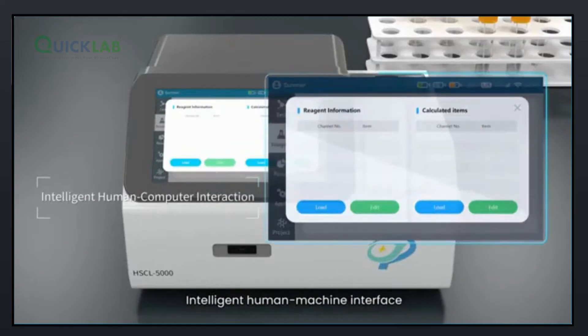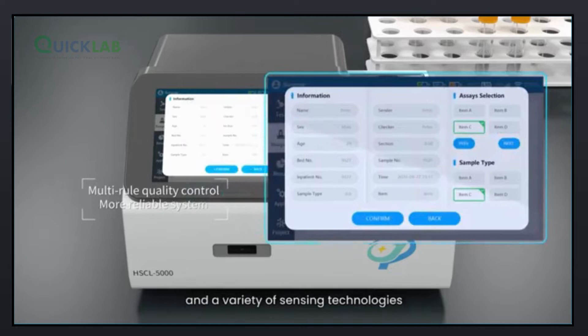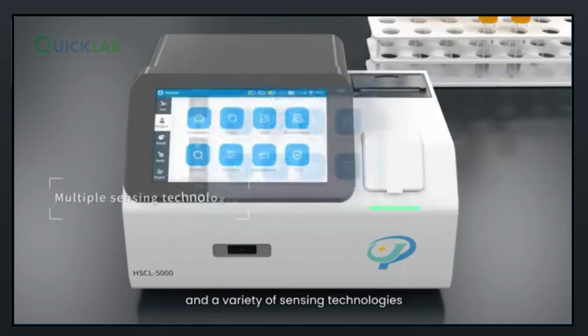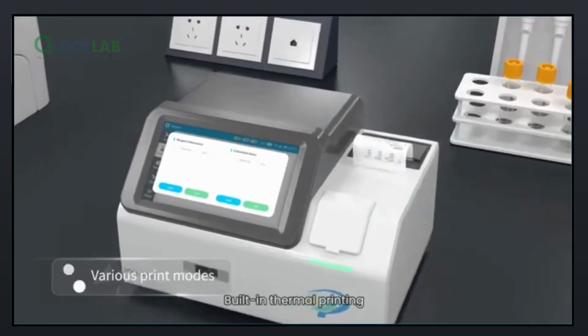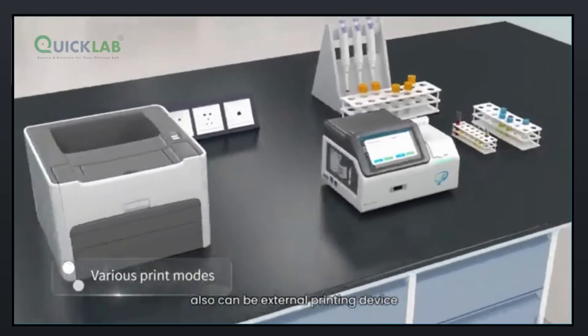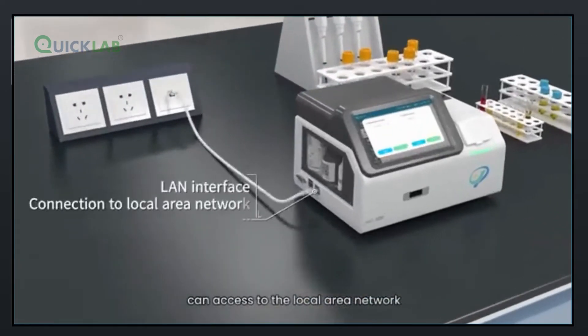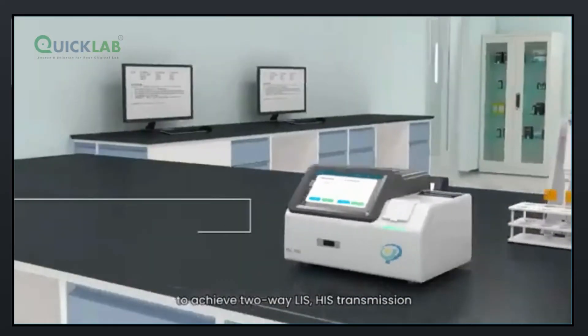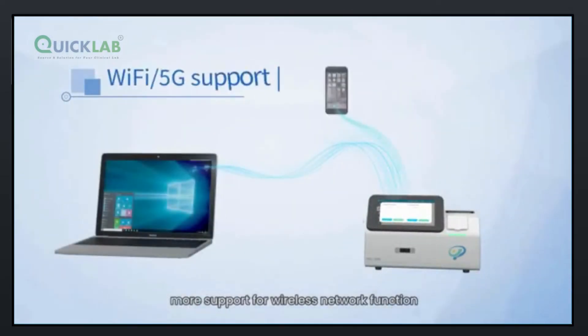An intelligent human-machine interface features built-in multi-rule quality control functions and a variety of sensing technologies, forming an advanced and stable system. Built-in thermal printing is included, and an external printing device can also be connected. The instrument can access the local area network to achieve two-way LIS-HIS transmission, with additional support for wireless network function.